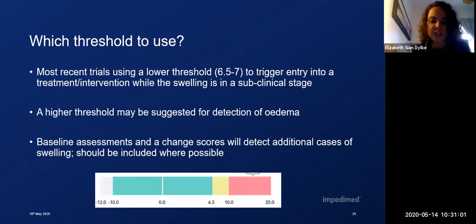But what does this actually mean overall? What does the research say about what threshold should be used? One of the early benefits of bioimpedance has been the use of normatively determined thresholds. This allows us to take normal human variation into consideration. No threshold will be perfect. All of them are a balance between minimizing false positives and false negatives.